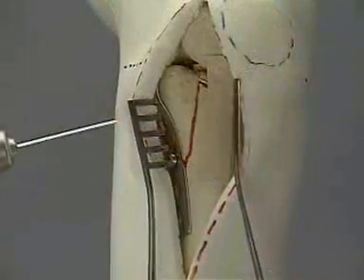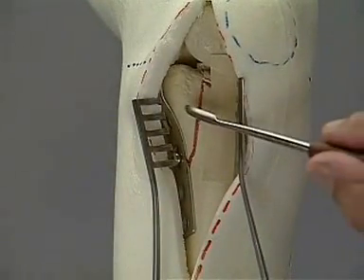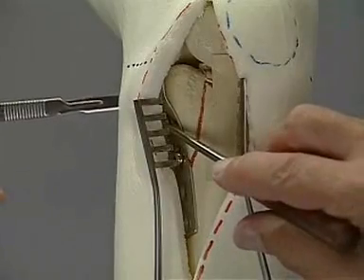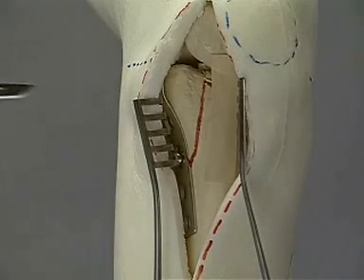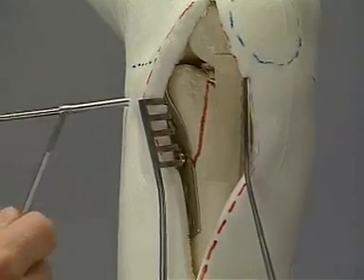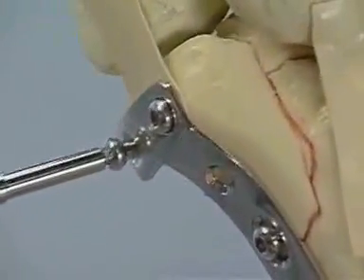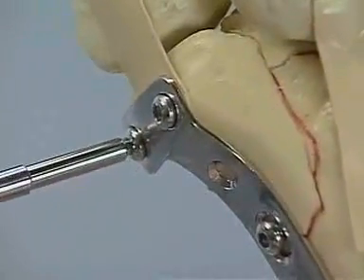The more dorsal hole in the L-plate is usually hard to reach from the front, so we suggest that a stab incision be added over the hole. Although not available for this exercise, the oscillating drill attachment can be of great help and increase safety in such situations. Care must be taken not to penetrate the medial cortex with screws that are too long, since this could easily irritate the medial ligaments and pes anserinus.